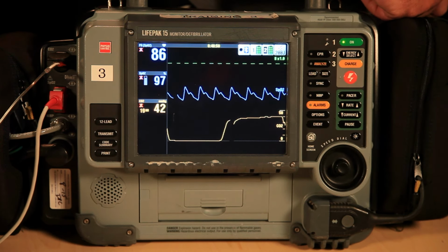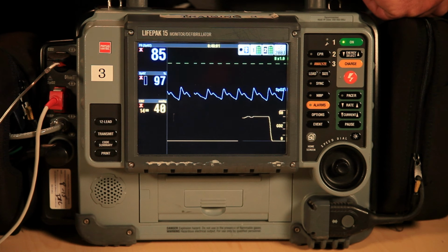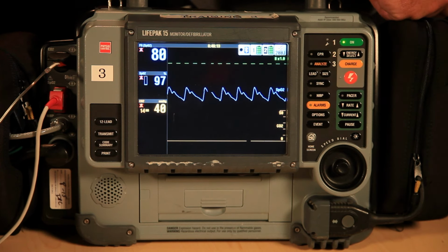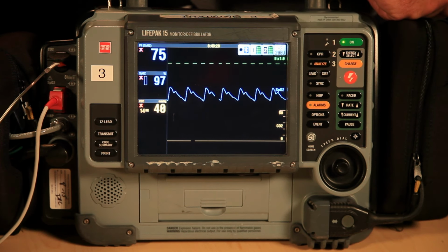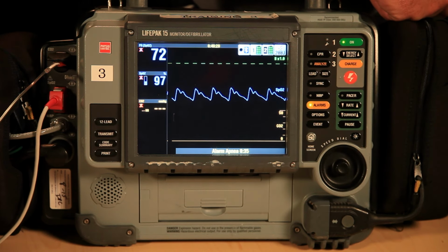If for some reason he were to go into respiratory arrest, you would notice that there are no box-shaped waveforms. His O2 sat's still 97%, but he's not breathing. This is real-time. Pulse oximetry is delayed. After a short period of time, it will set off an apnea alarm, and if Lieutenant Jacobs begins to breathe again, it will clear that alarm.